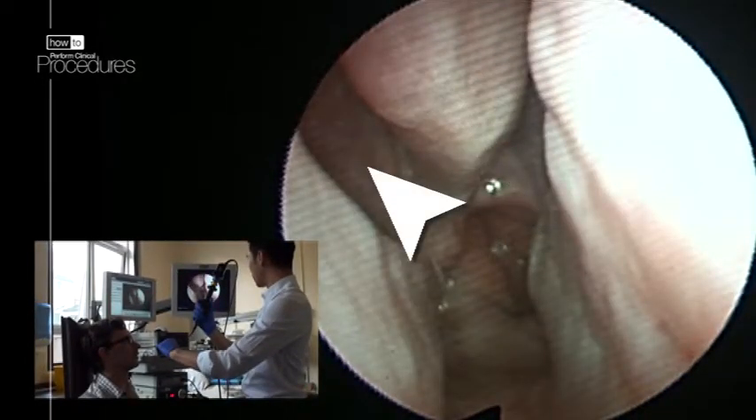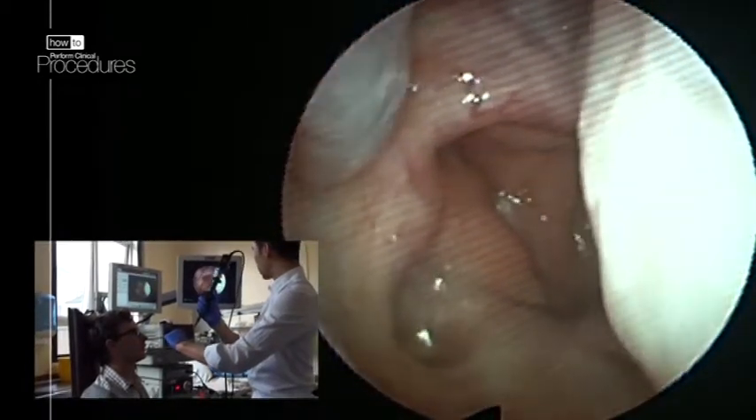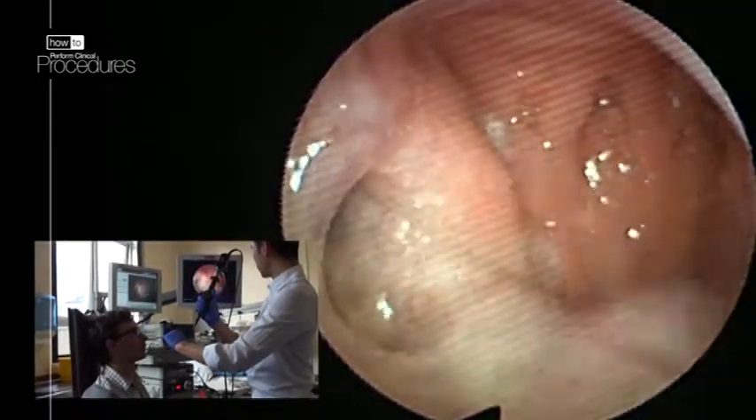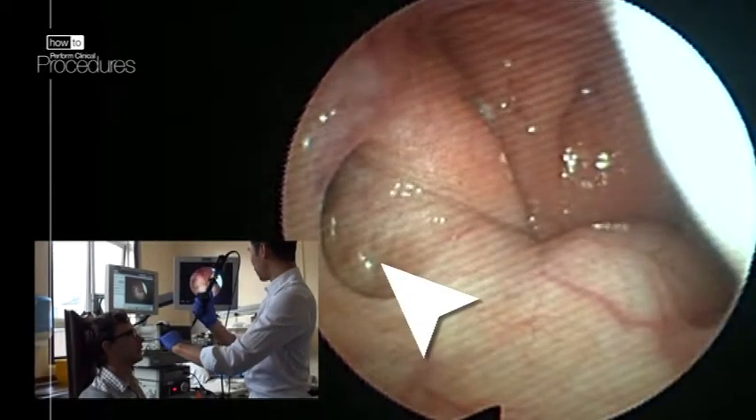The middle turbinate and middle meatus are visible. Continue through the nasopharynx. Ask the patient to swallow. The soft palate is moving on the left. The eustachian tube orifice is visible.